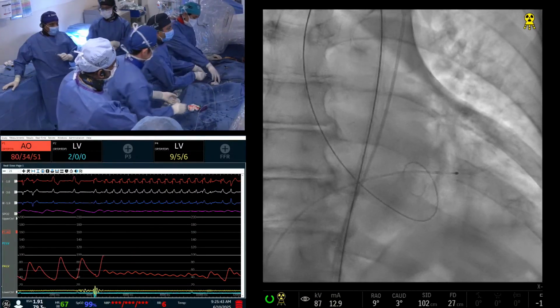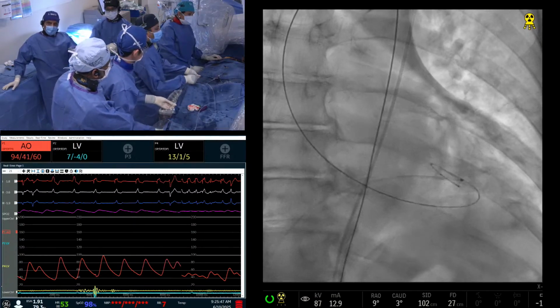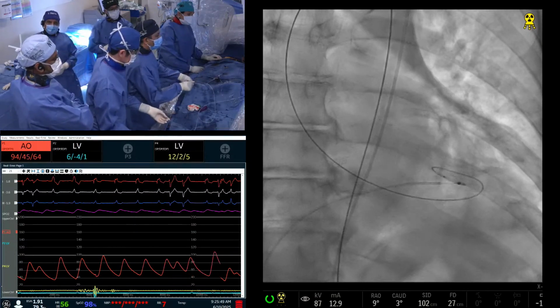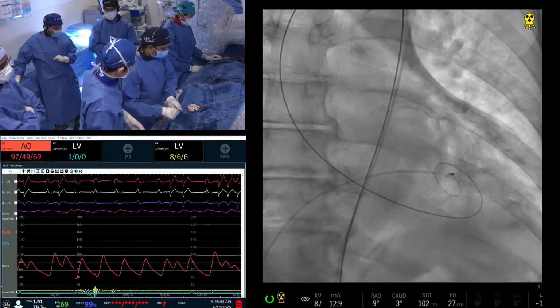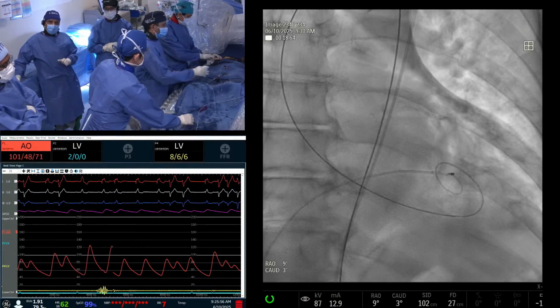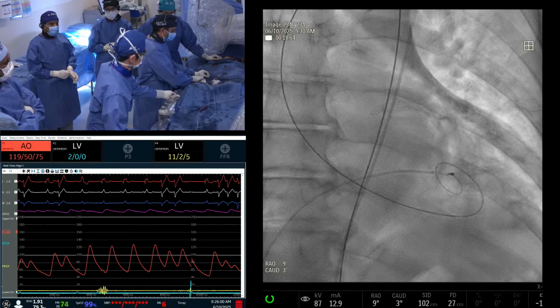And we looked into it. Every aspect we did correct. The sizing, dilatation. Now, of course, the second tap, the post-dilatation, I mean, two times will decrease that incidence, and that needs to be seen. But the TAVR valve recoil is a true phenomenon. I know it has not been talked about much, but that is what we have seen in real life.